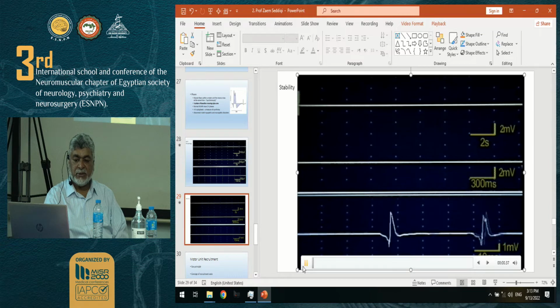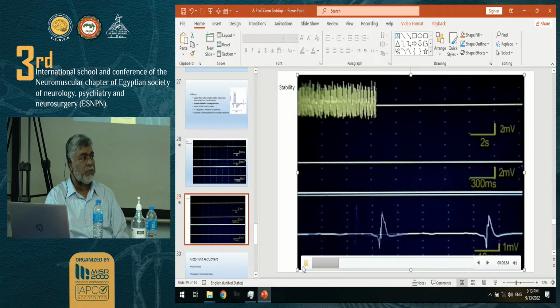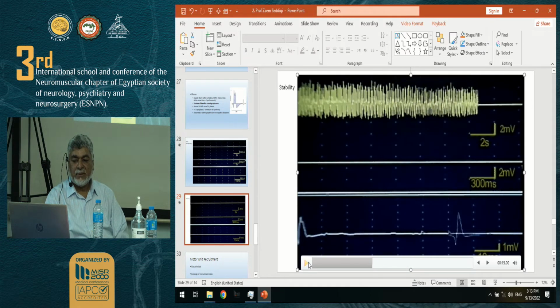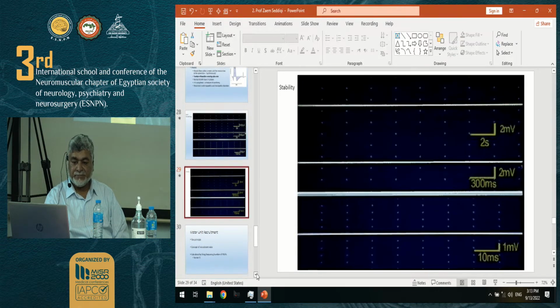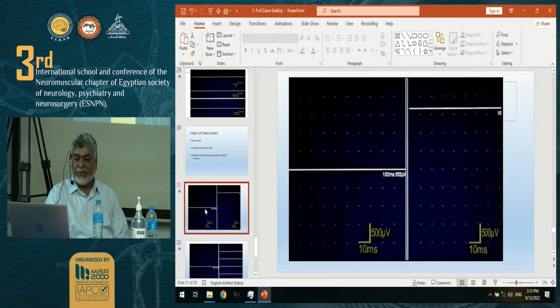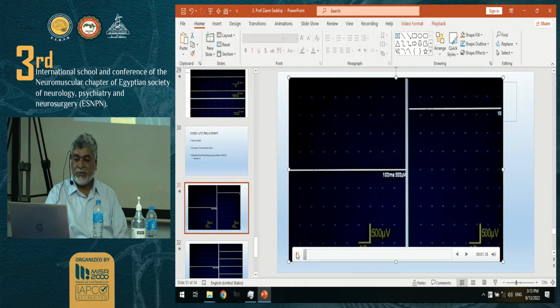One more time. Got it? Got the concept? Early reinnervation, we look for carefully in motor neuron disease particularly. Okay. I told you about the recruitment concept. I just want to run it by you one more time to get it in your system.